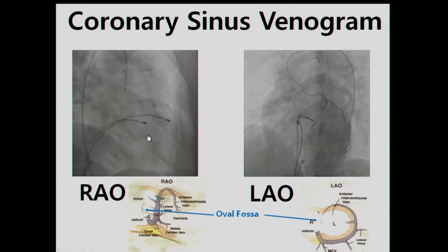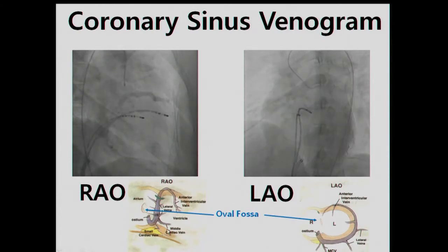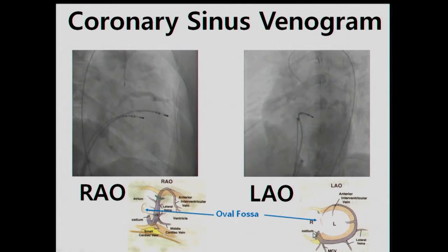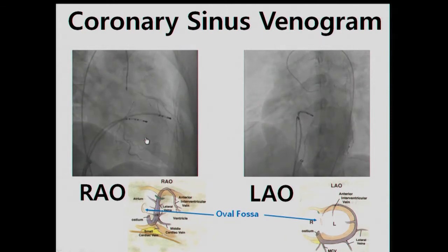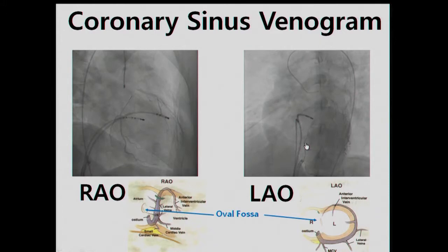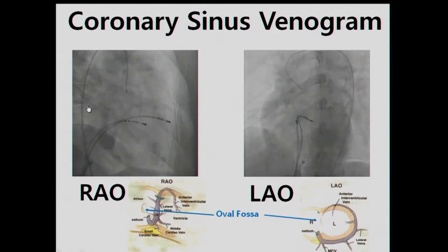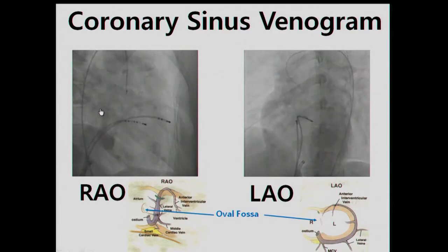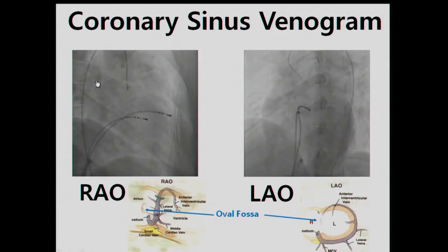These are angiographies on RAO view and LAO view. The left panel shows the coronary sinus venogram on RAO view, and the right panel shows the coronary sinus venogram on LAO view. You can appreciate the obvious coronary sinus on RAO view and LAO view. Also, you can see the posterior cardiac border in front of the thoracic vertebrae. Therefore, you can estimate the location of the fossa ovalis between the coronary sinus and the posterior cardiac border.